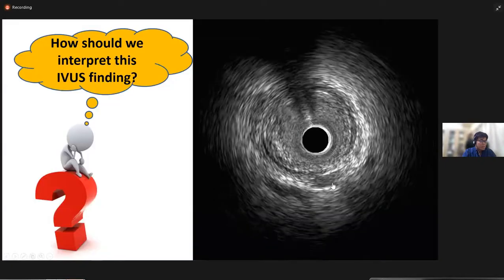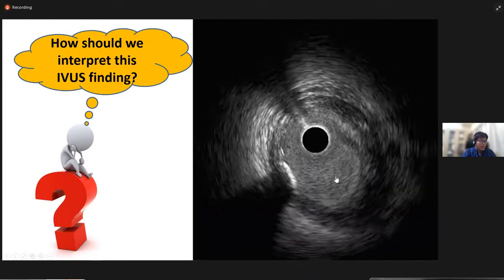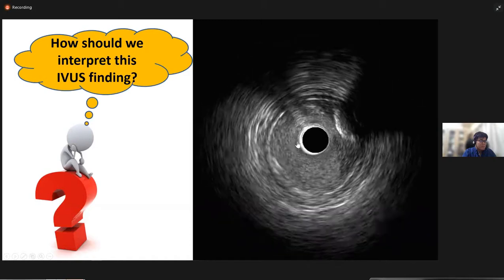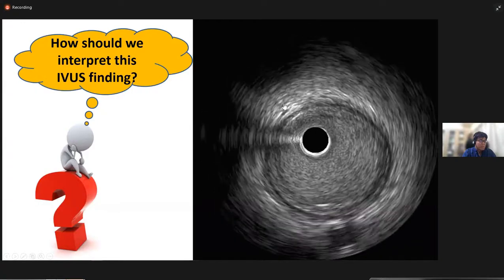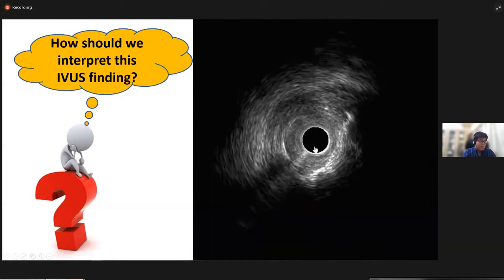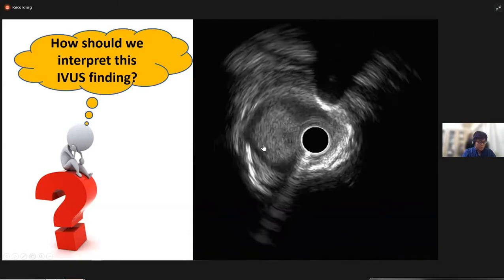Now the septal branch is coming from 4 o'clock or 5 o'clock, and this is the target region. The split is coming soon. This is a diagonal branch. This is the tightest point. High lateral branch and circumflex.